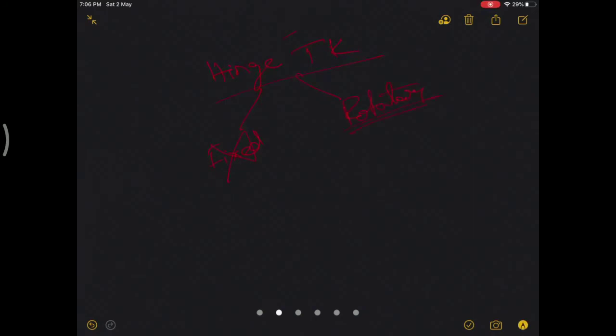You have a long rod which goes in the femur, and this will have global stability with rotation. So you are not locking a hinge like this. If you have seen a total elbow, you know what a fixed hinge is: if you lock it, there is no rotation, it just allows flexion extension.